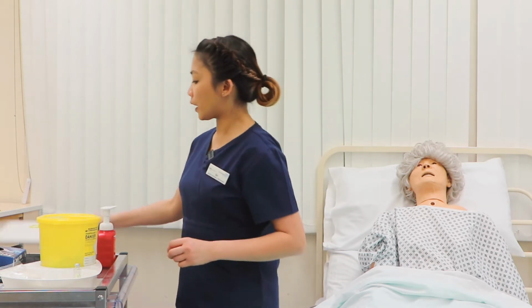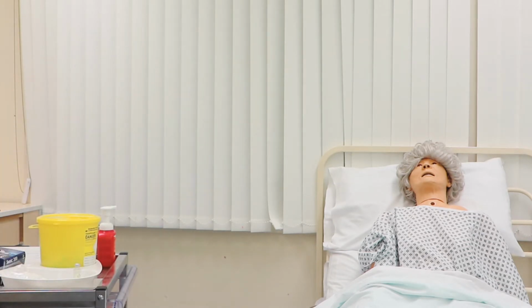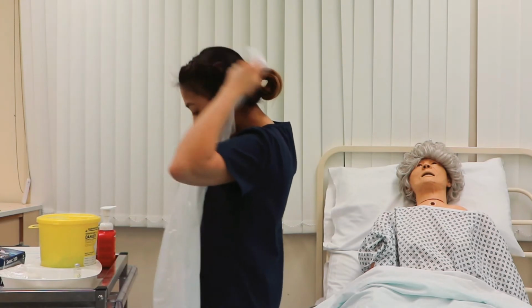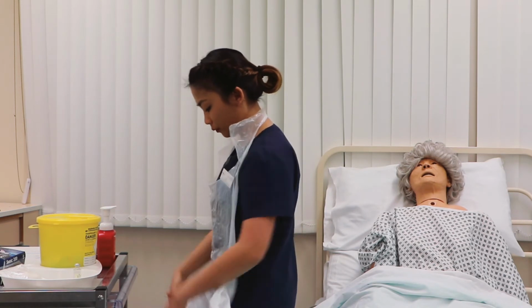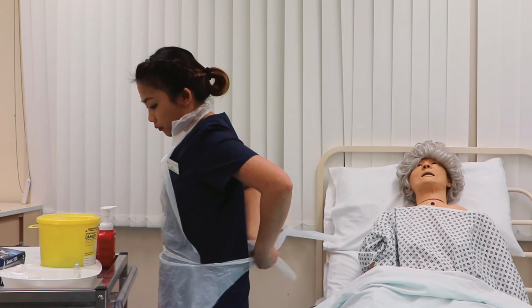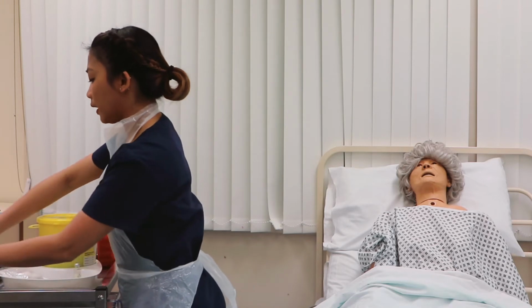Now, I'm going to prepare my medication. I'm going to wear my apron, making sure that the clean part is facing my patient and it's not touching the floor. Hand rub. Don my gloves.